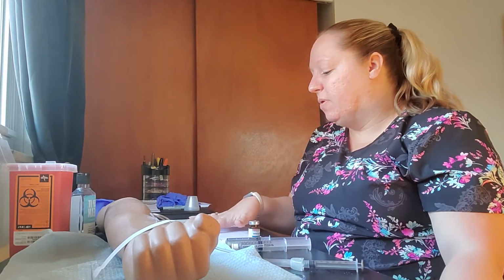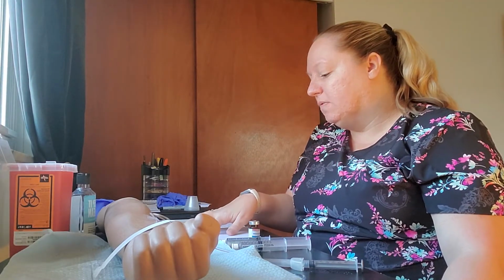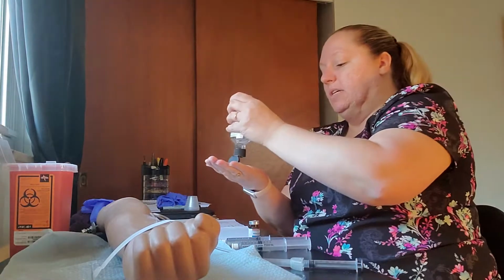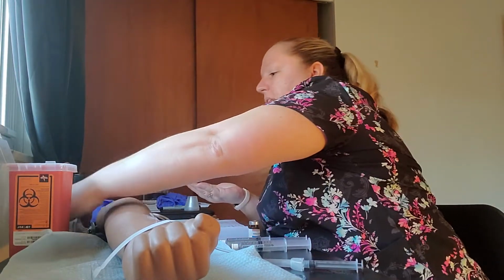All right. So again, that order is today. She's getting bumetanide 0.5 milligrams, or Bumex is what we also call it, IV push over 60 seconds. So the first thing I'm going to do is do my hand sanitizer or hand hygiene. I want to check and make sure that I am doing my 6 rights of medication.